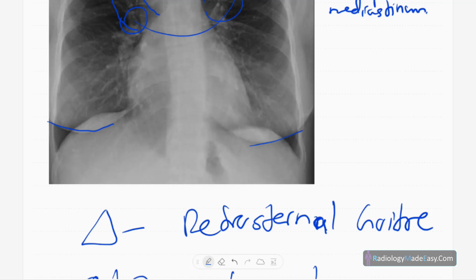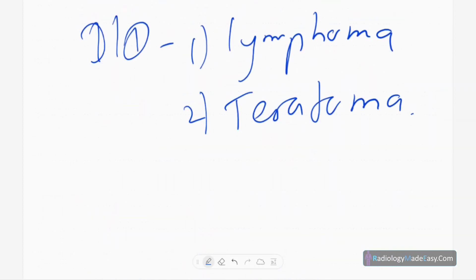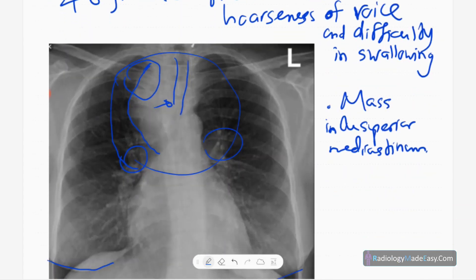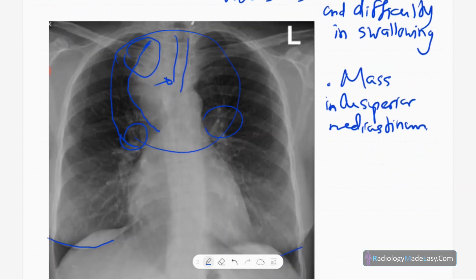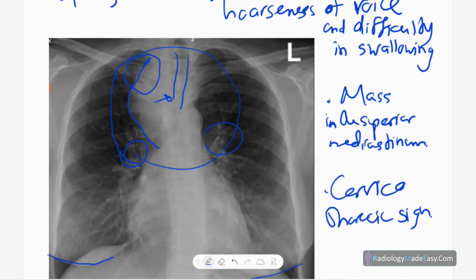In retrosternal goiter, you should look for any calcifications, as goiters commonly calcify and this is an important clue for the diagnosis. The tracheal shift is also a clue, and the cervicothoracic sign — where the mass extends above the clavicle — is another key clue for the diagnosis.